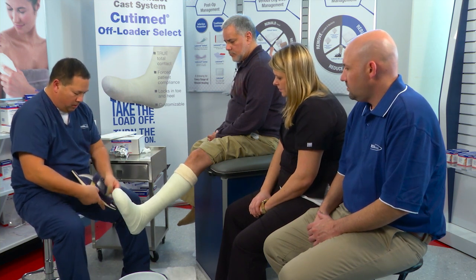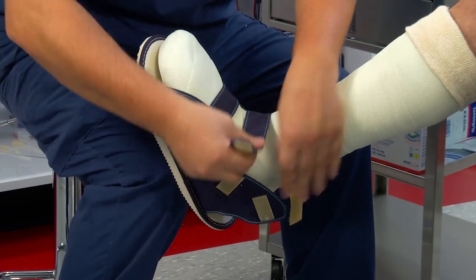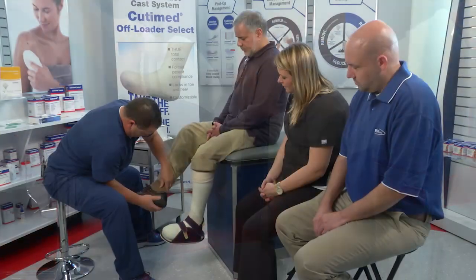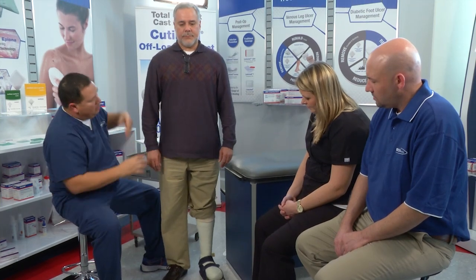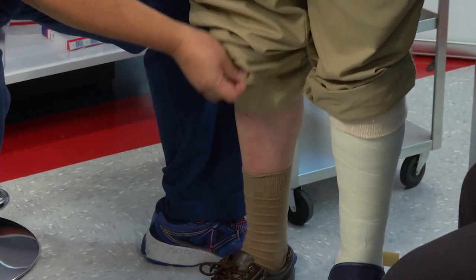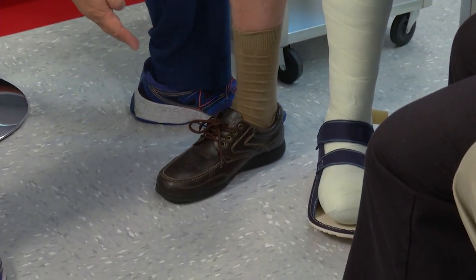I'm going to apply a cast shoe and have him stand here. Notice — hands on your hips — that the shoulders are level, the hips are level, and his knees would be even.